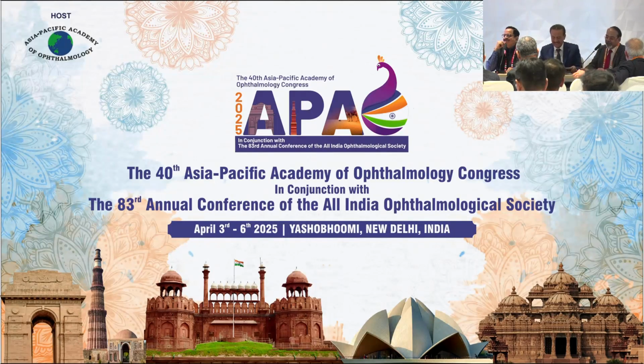I think he has actually dealt with both the posterior capsular rent and the flag sign, Argentinian flag sign, very well. And the most important thing is to manage it, do not panic, and be peaceful in your mind, so that you are not in a hurry to do it, and then probably in all the cases you will be able to manage it. Whatever is there, I think it can be managed. We are all very experienced cataract surgeons, so these are the small issues which keep on coming in.